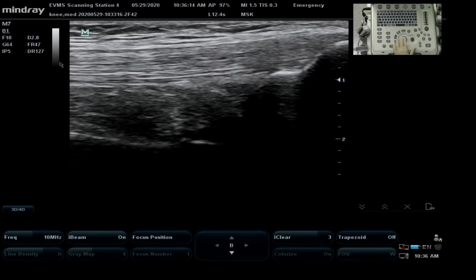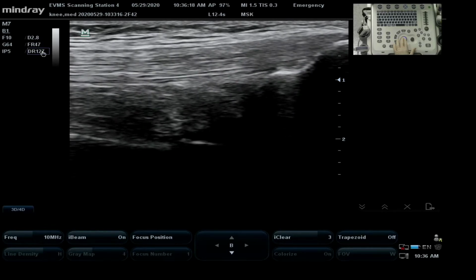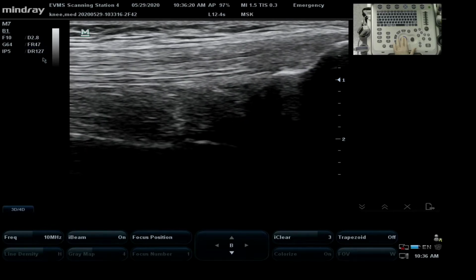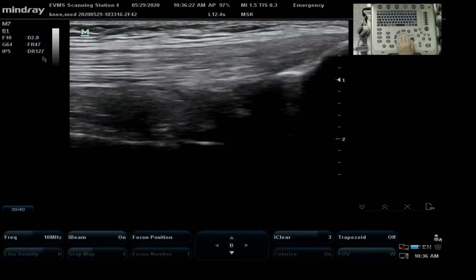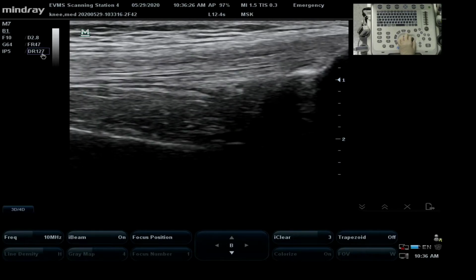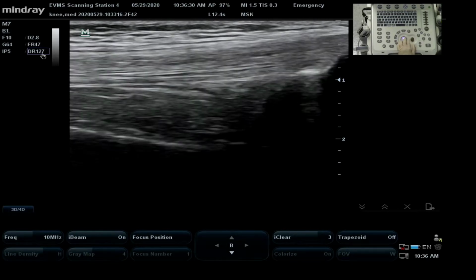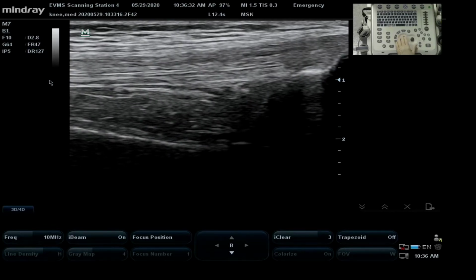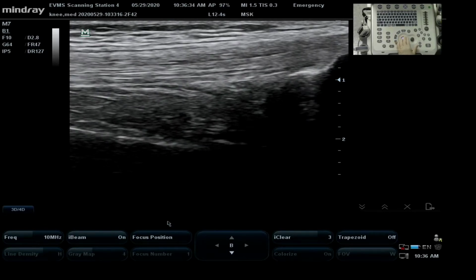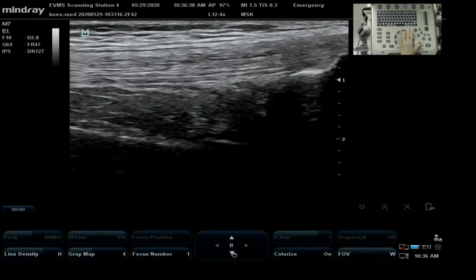However, if you ever want to change this, change it lower, not higher. And to do that, there's two ways that you can do this. You can see that when I hover over this, that it highlights it. And if I use my radio dial, it's not going to work on this particular machine, so I take it back. I'm going to take this back down to my menu, and I'm going to click downward on the menu.